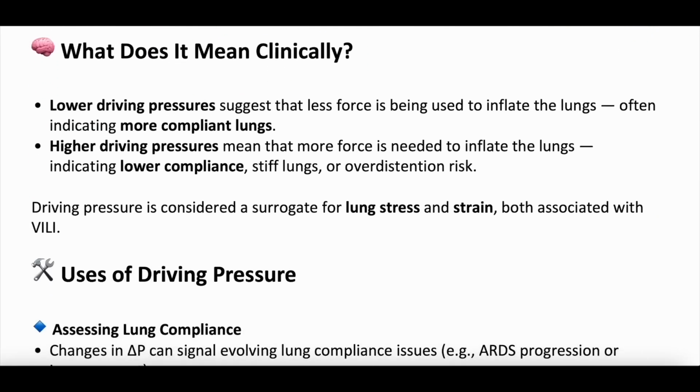Well, as we mentioned, lower driving pressures suggest that less force is being used to inflate the lungs. And this often indicates the lungs are at a better, more optimal compliance, whereas higher driving pressures mean that there's more force needed to inflate the lungs, and the lungs have kind of a lower compliance, aka stiff lungs or over-distended lungs. So lower driving pressures are quote-unquote good. Higher driving pressures are quote-unquote bad.